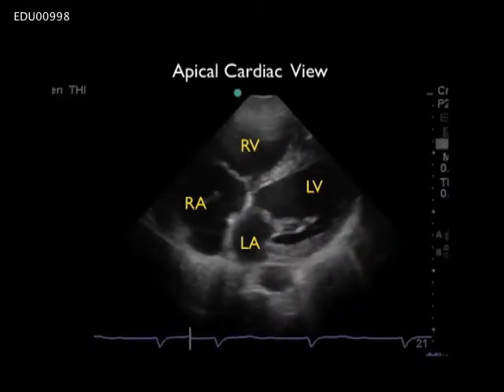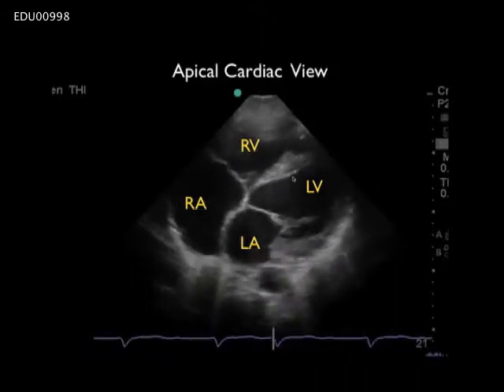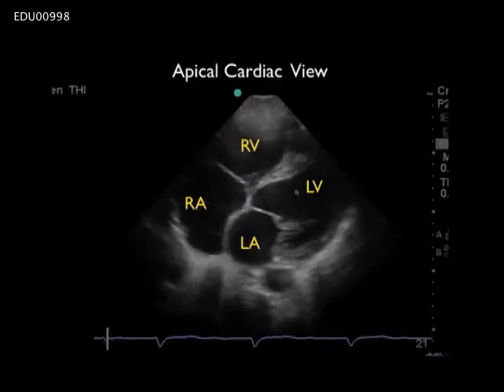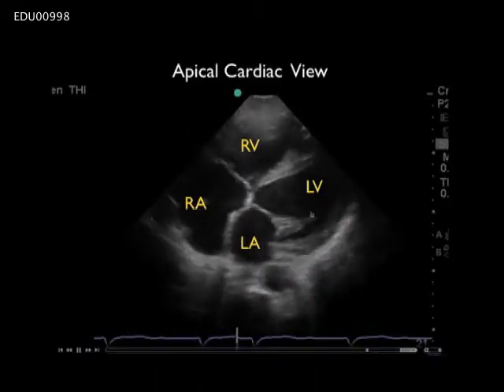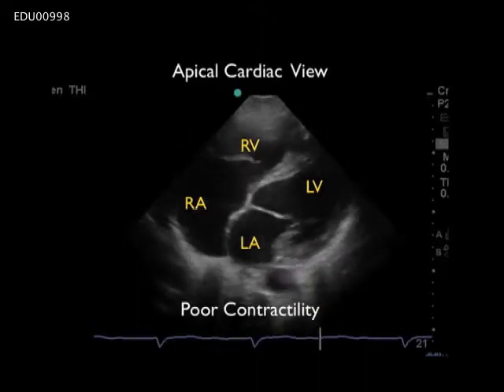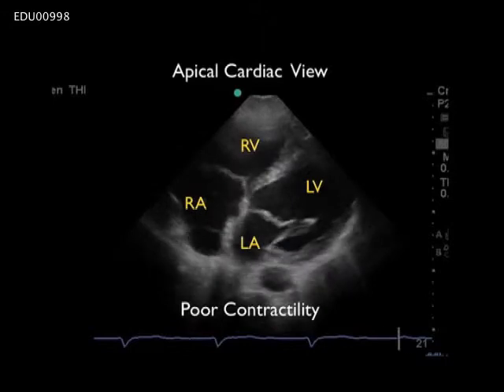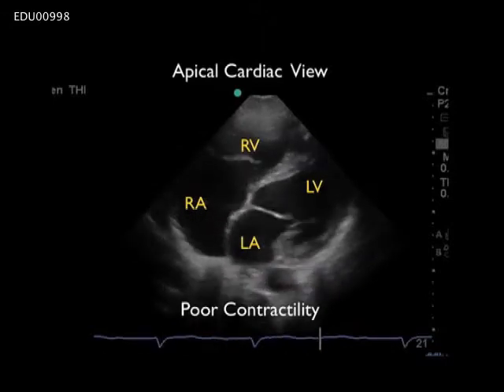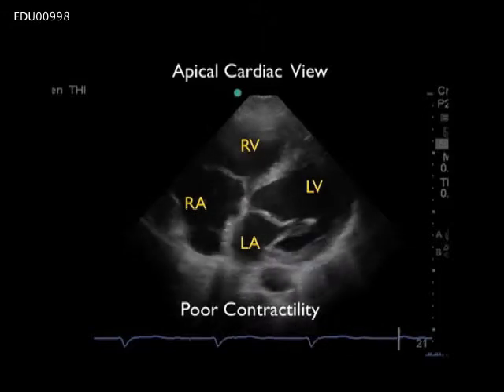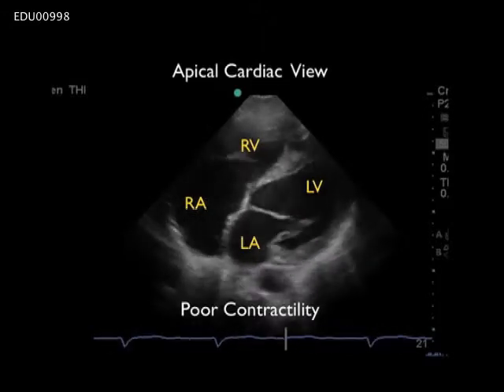Contrasting with an apical four-chamber view from a shock patient, we again see the left ventricle to the right and the right ventricle to the left. Here we notice very poor percentage change from diastole through to systole of the left ventricle — very poor contractility — and in this shock patient we'd have to be careful about the amount of fluids given prior to pressors, as we don't want to throw the patient into pulmonary edema.